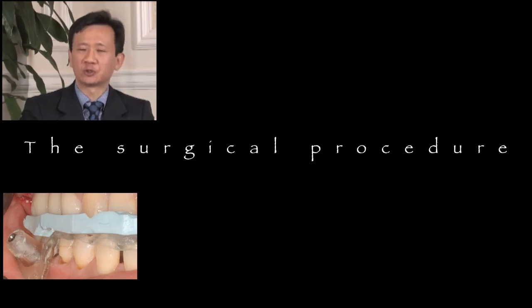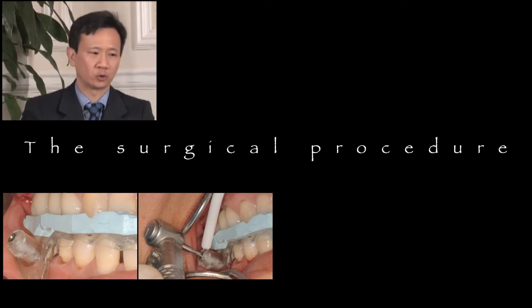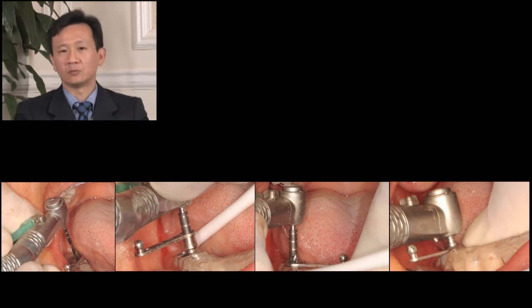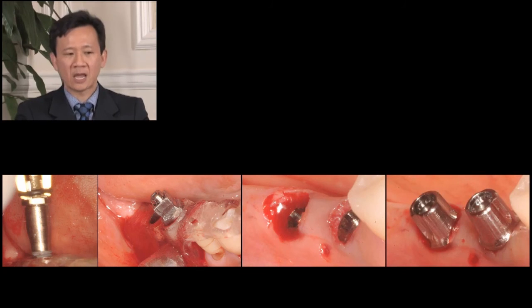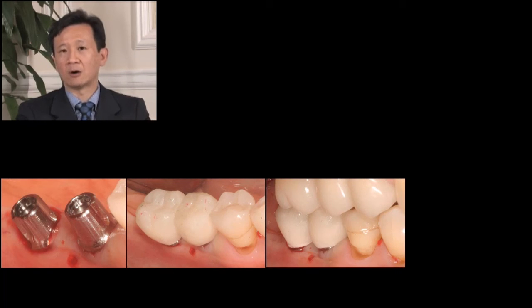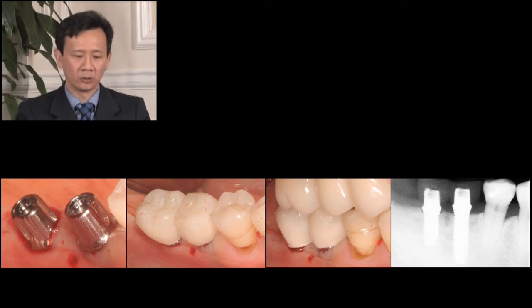During the surgical procedure, the surgical template is inserted and the patient is seated into the surgical index to make sure that we have the proper placement of the surgical template, and an anchor pin is used to help hold the surgical template. Once completed, the surgery can begin with the start drill, 2mm twist, 3mm twist, and then implant placement. As the implant is placed and the procedure completed, the abutments are inserted and the provisional restoration cemented in, keeping it out of occlusion so that it is truly provisionalized, immediate provisionalization, but not truly immediately loaded.